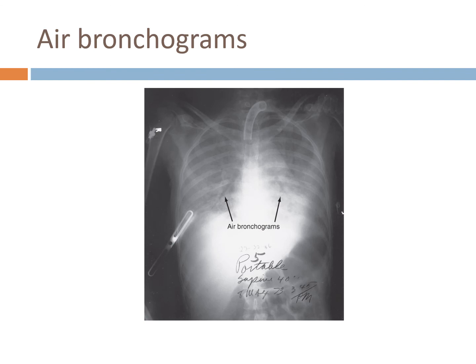And there are some different examples in your textbook, and I think this one might have come from your book. You can sort of see it here, on this left side. It almost looks like a little tube or a little straw where the air is surrounded by white. So it gives it that definition. I think that was the word I was looking for, definition.